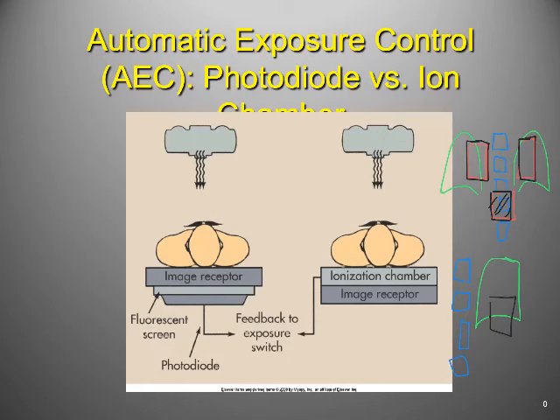So, two big takeaways with this. Number one, the AEC is your friend. Your techs use it a lot, right? Number two, big point, it is not to be a crutch, right? You would not like it if your friend used you as a crutch for everywhere that you go, right? Don't use the AEC as a crutch for everywhere that we're trying to shoot x-rays, right? There's going to be times when we need to just set a manual technique. If the anatomy does not fit and fully cover the ion chamber, if there's patient care considerations that don't allow us to use the ion chambers at all, we need to be able to set a manual technique.